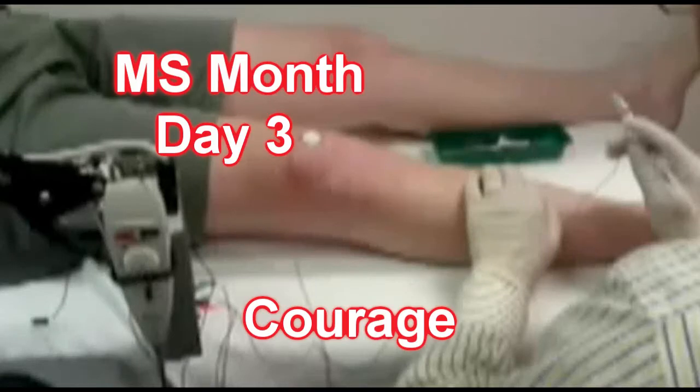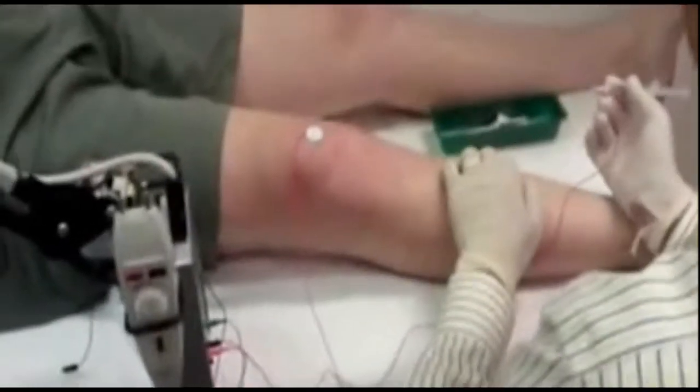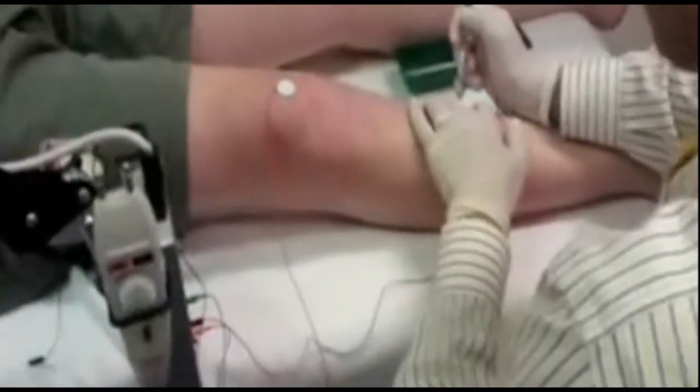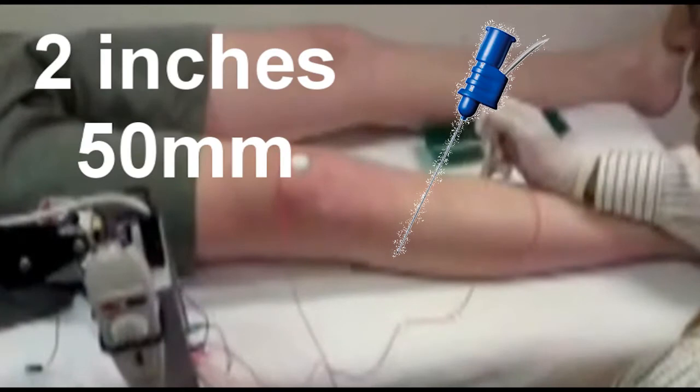Hi guys, Michael speaking, the guy with MS. Here the doctor's going to inject some Botox into my right leg to stop the muscles from spasming. Now the doctor puts the needle into the leg, approximately 2 inches.